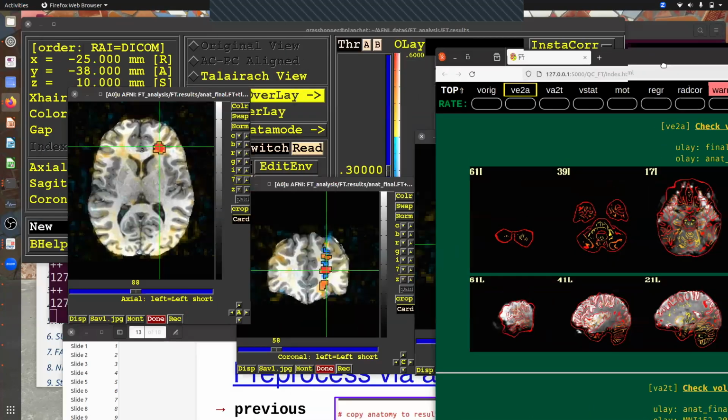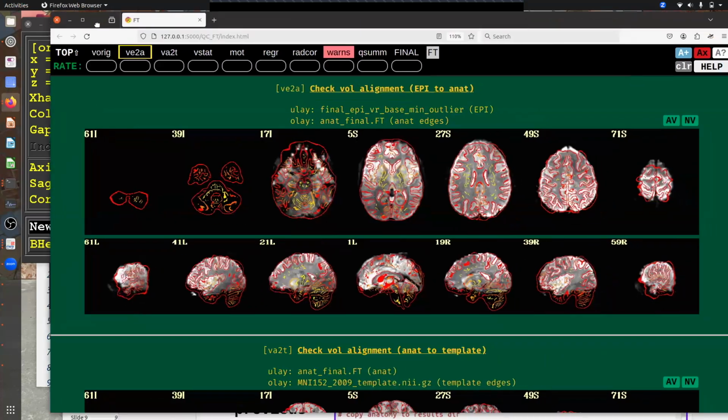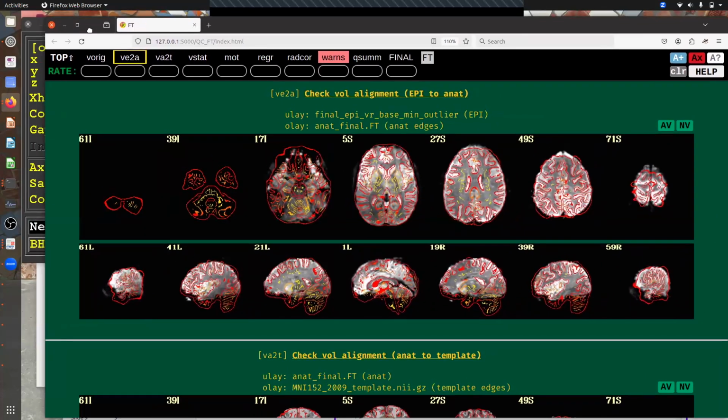You also have to accept the fact that real data has real weird stuff, whether it's noise or minor artifacts, and you have to understand what's causing it as much as possible and whether it's going to affect the scientific questions you're actually going to answer. Something weird happening in the front part of the brain, if you're only caring about the visual cortex, might be okay. But if you're doing a whole brain study, no. These correlation, anti-correlation patterns may be okay to see in a task-based study, but it'd be devastating in a resting state study.